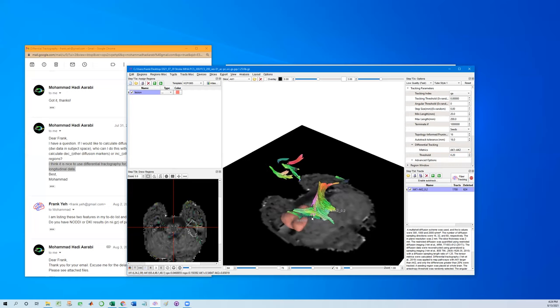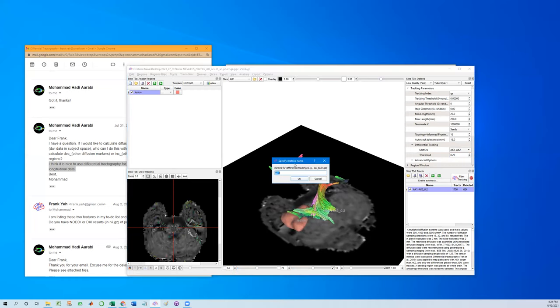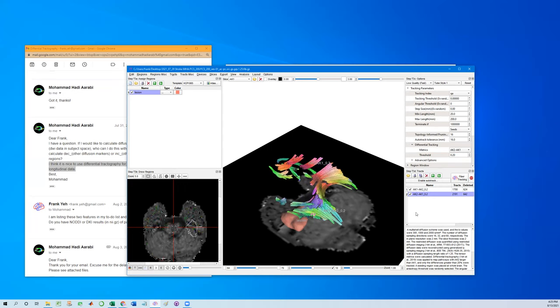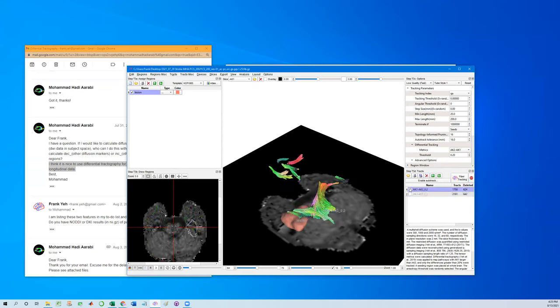Similarly, I can also map the increase of axial kurtosis by assigning AK2 minus AK1. You'll see another new metric added here. Select them and click tracking. So those are increased more than 20%, whereas this is decreased more than 20%.